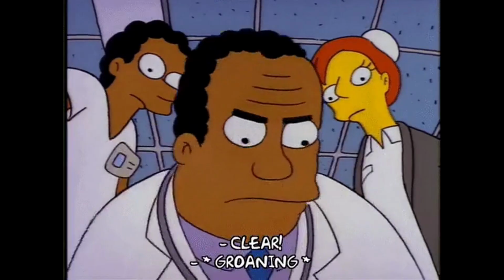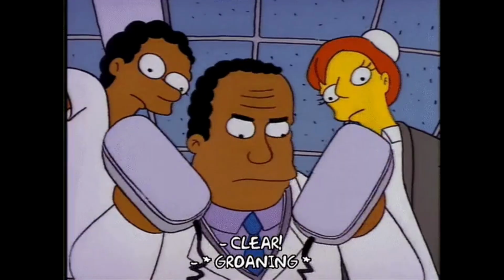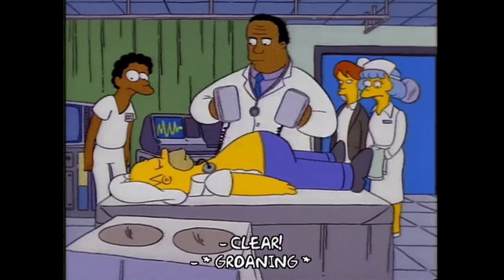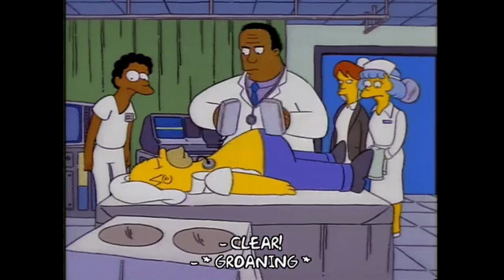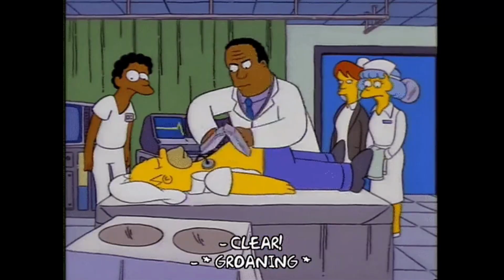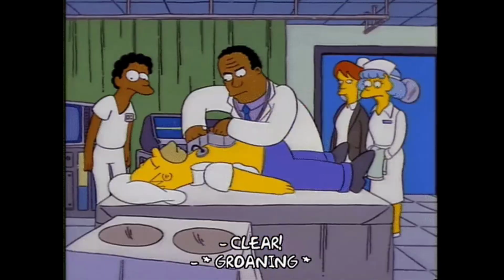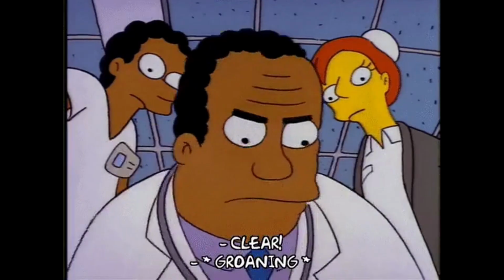If the pads are not put on properly, the automated external defibrillator may repeat "check electrodes." If you found an implanted device or piercing, the pads should be at least 1 inch from them. 5. Let the automated external defibrillator analyze. Once the pads are properly in place, you need to get everyone clear of the victim. When everyone is moved back, press the Analyze button on the automated external defibrillator.